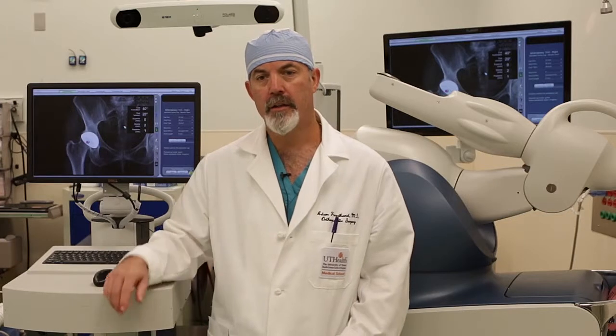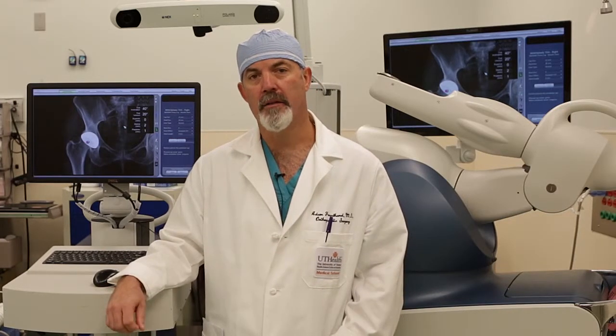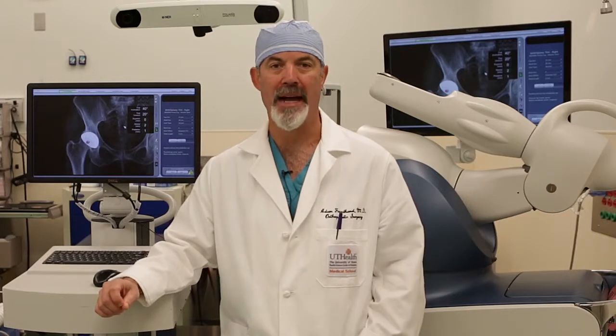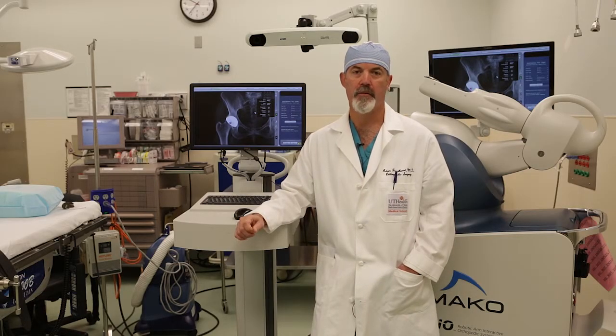This is the workstation, and we've gone through the preoperative planning. Intraoperatively, there's a tremendous amount of flexibility to this. So in the partial knee replacement world, for example, we're able to modify the plan to achieve ligament balancing intraoperatively. And that's really what it's all about in terms of getting the best outcome for a patient.